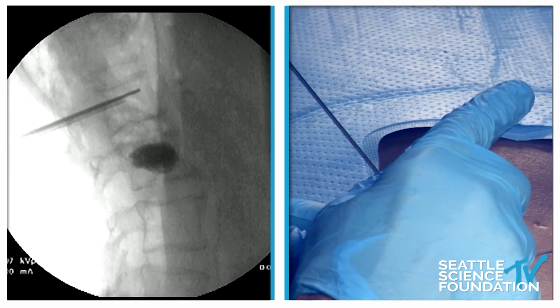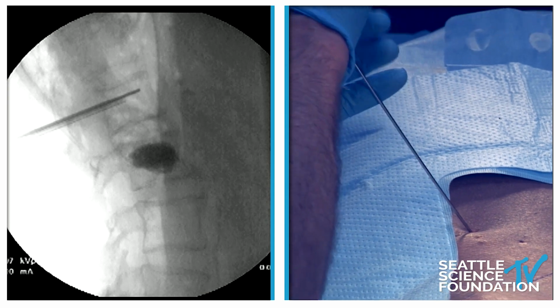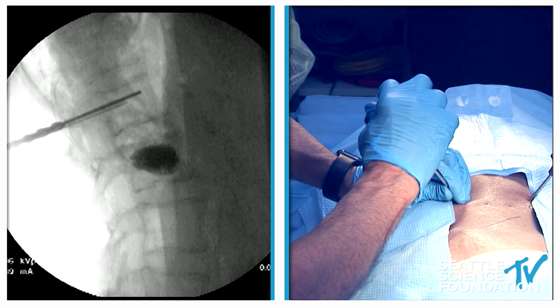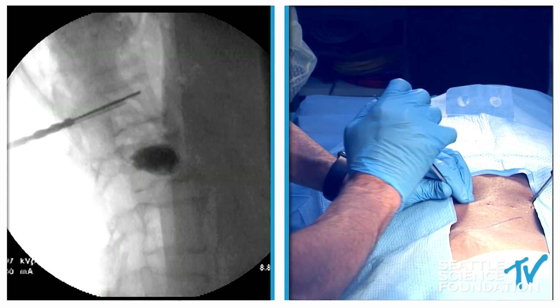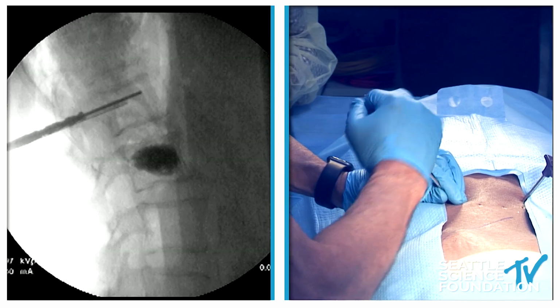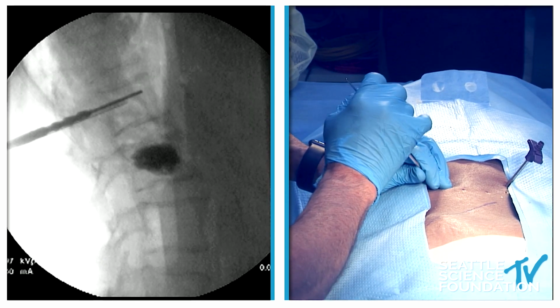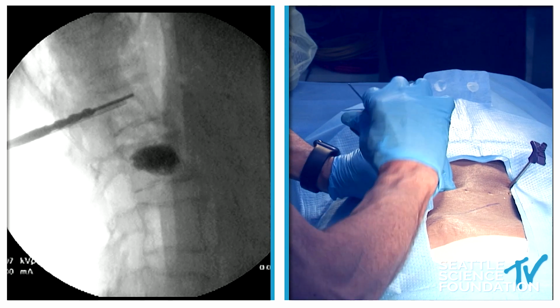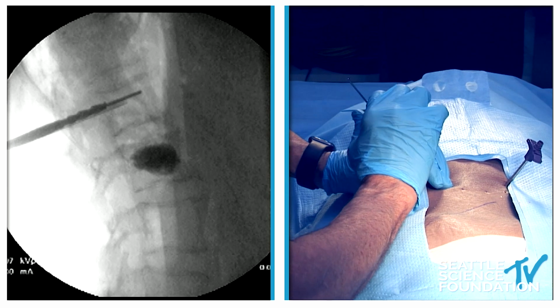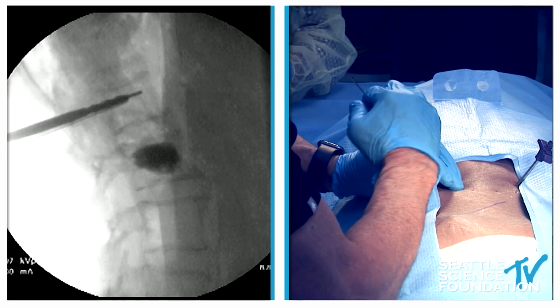And this portion right here, we also know whenever we get it into the vertebral body, which I'm going to start right now, we'll be able to see where the final size and resting place of the implant will be. So we'll go ahead and turn it all the way toward the front part of the vertebral body over the K-wire, making sure the K-wire doesn't advance. If it does, you grab it with a coker and bring it back. That's a critically important thing to remember, that the K-wire not advance. So you want to watch this in the lateral, because if the K-wire advances, big red and big blue are out the front of that vertebral body.